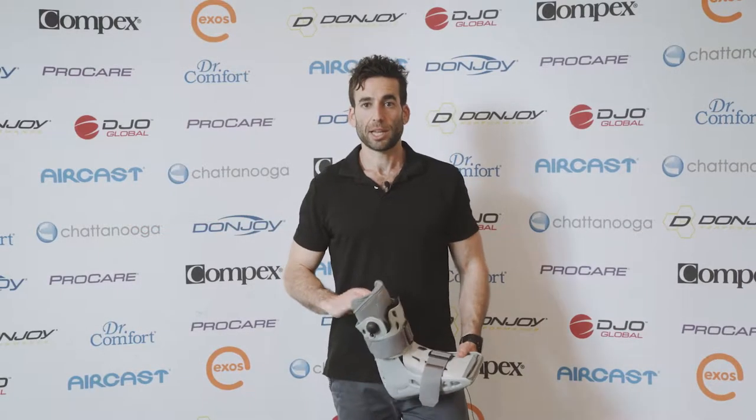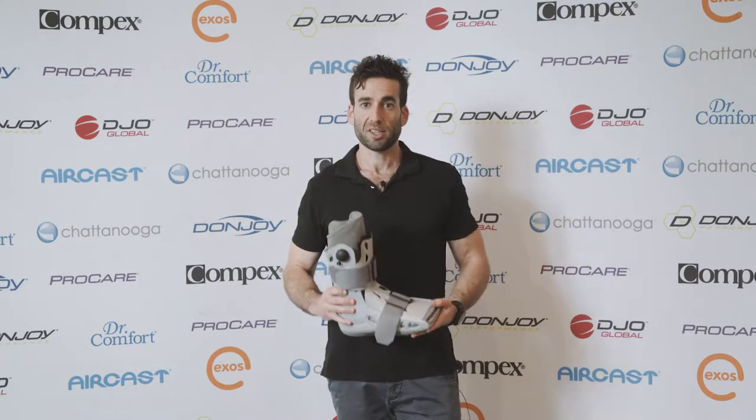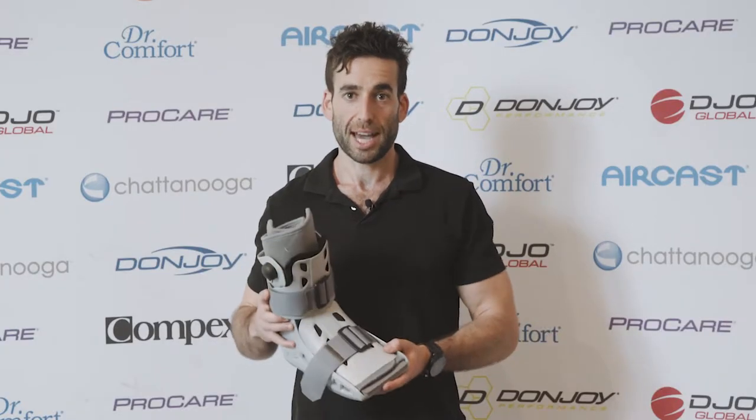Hi, my name is Daniel and I work at DK Physio up in Edgecliff. One of the pieces of equipment I use quite often for any type of ankle injury is the air cast cam boot.